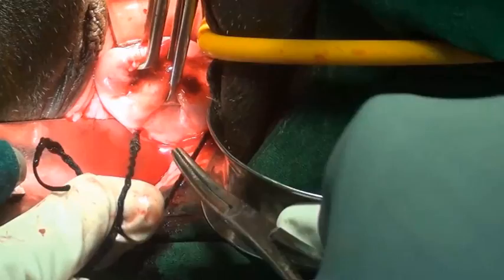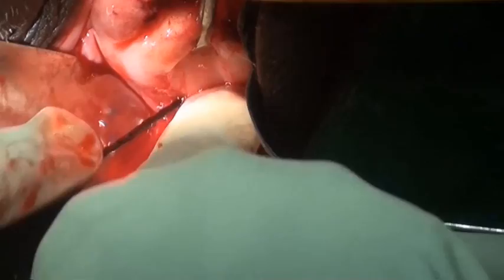By this technique you can place a very strong, very precise cervical cerclage suture. If you want to go further high, you can even open the pouch of Douglas and reach the abdominal cavity and perform cerclage just as you would in abdominal cerclage or laparoscopic cerclage.